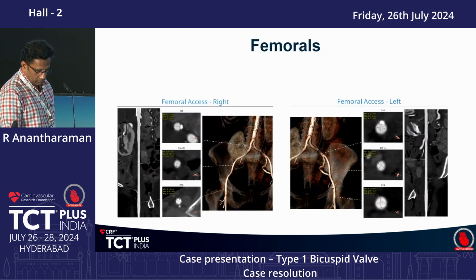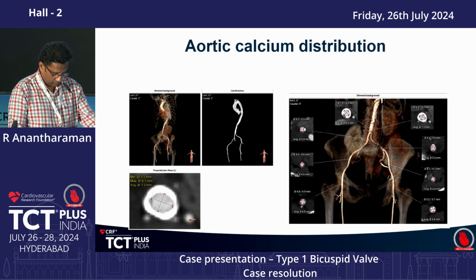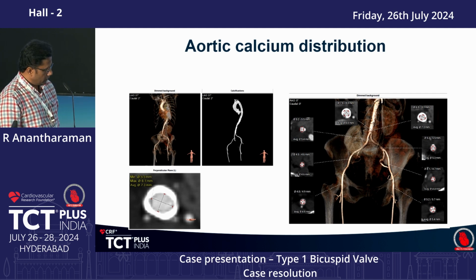Look at the femoral vessel. She's a 40-kilogram patient. Last thing you want is a femoral vascular complication in these patients. So as we all start a TAVI program, you have to tailor the valve to the femoral vessels. So in this particular case, I have to go with a self-expandable. Yeah, no, I think from an annulus perspective, it could be balloon expandable. You could do a 23. You have to be cautious.